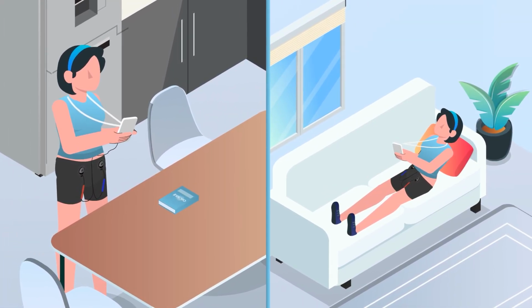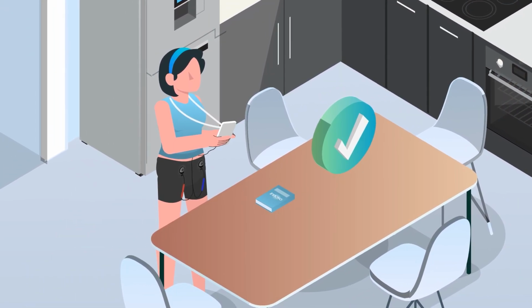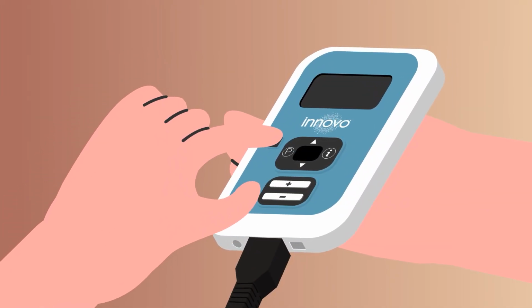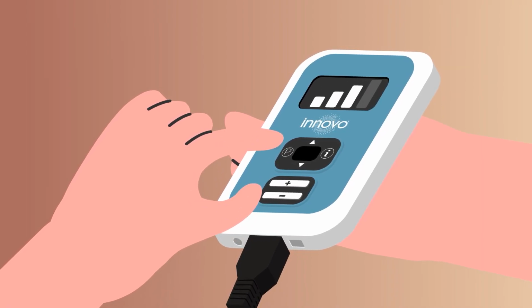Choose whether you will carry out your session in the standing or lying position. For best results, we recommend you use INNOVO in the standing position. When in position, turn on the controller by pressing the power button. Press the plus button to start your 30-minute session and increase the intensity.